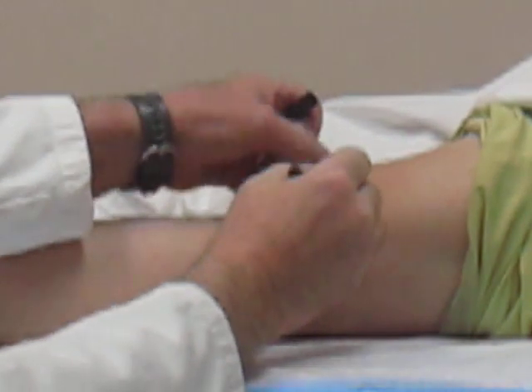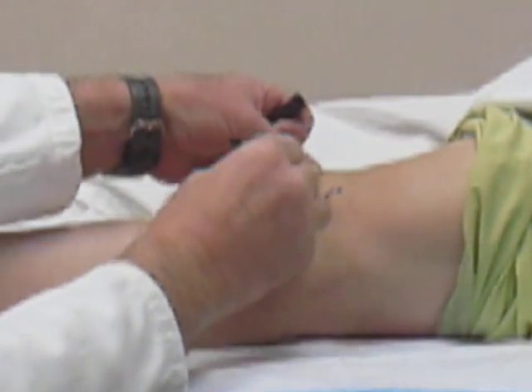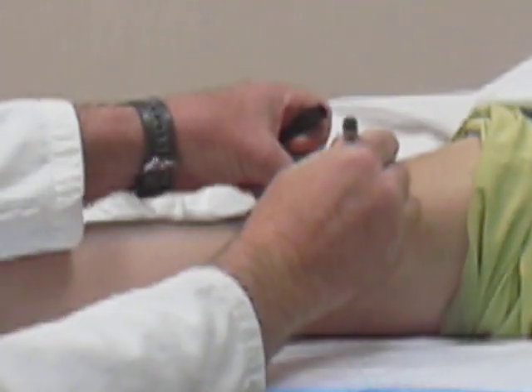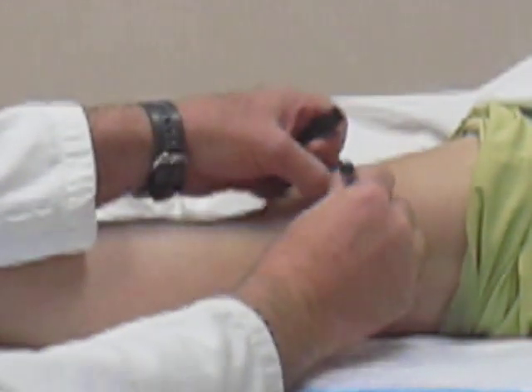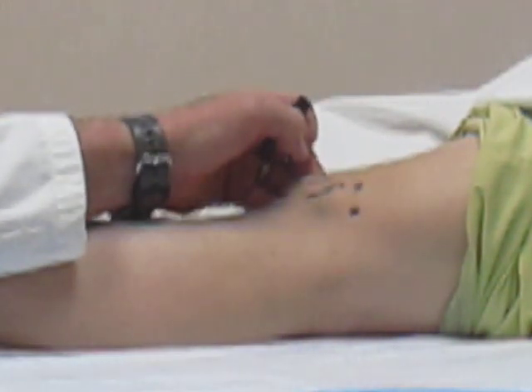I'll identify the superior portion of the patella, the lateral patella, and the inferior pole of the patella. I'll also identify the supralateral portal or portion of the patella, and then as I palpate the quadriceps tendon, I'll identify the mark below the quadriceps tendon — that will be the point where I go to aspirate the joint.